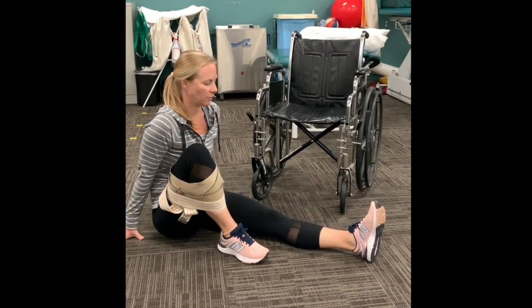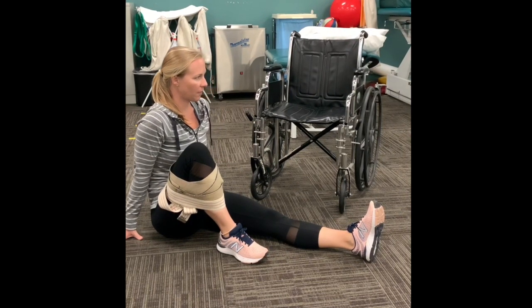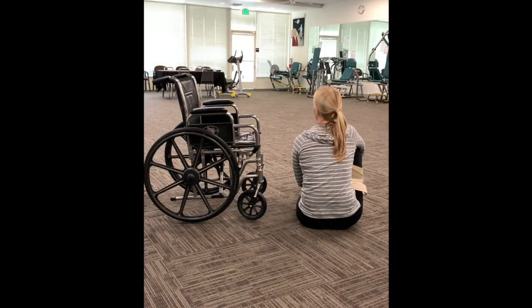The patient will first assume a long-seated position and place their wheelchair on the sound limb side. At this point, the patient may apply the brakes if needed. After, with a fully extended elbow, they will place their hand on the floor towards the wheelchair. Then they will roll over towards the sound limb side, coming to a kneel in front of the wheelchair with both hands on the wheelchair for support.